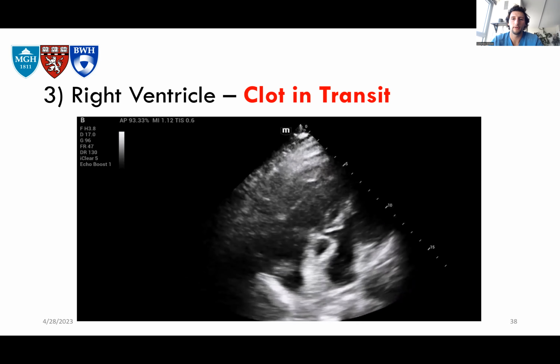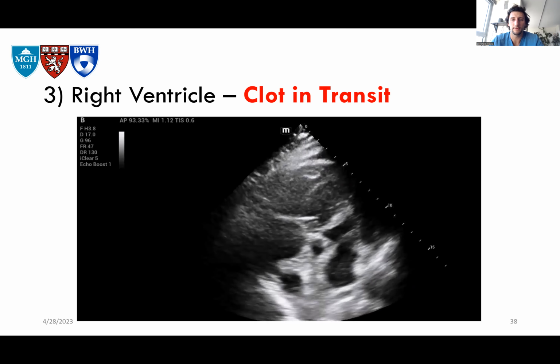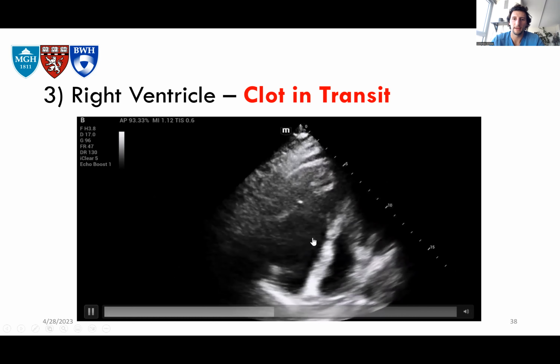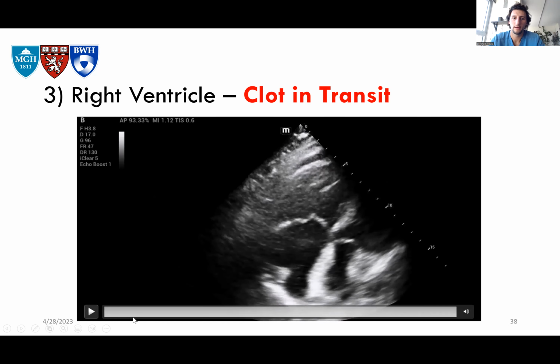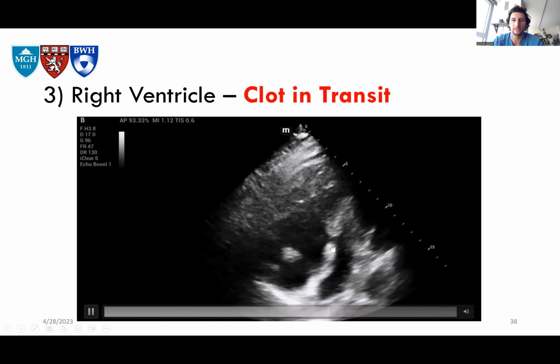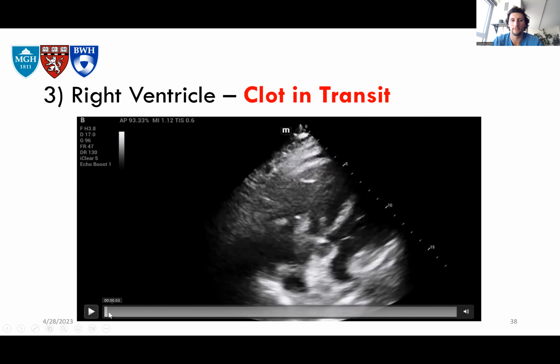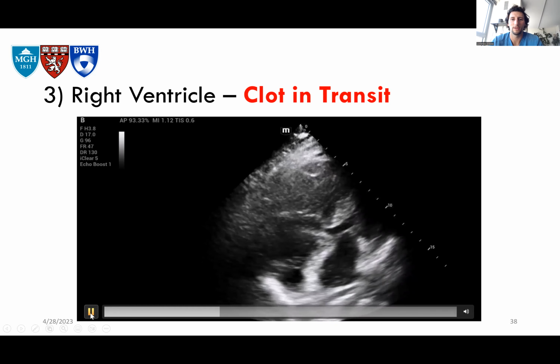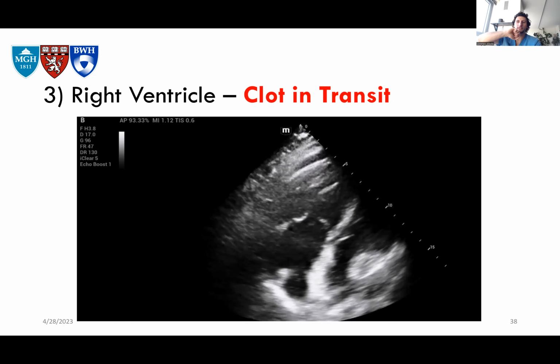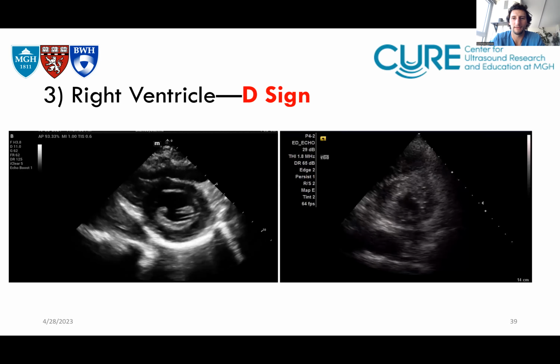This is an example, very rare. I've never seen this before, but it'd be kind of cool to see. Oh, let's see here again. See that little thing ping-ponging on the left side of the screen, that little white, looks like a ghost that's ping-ponging in and out of the valve? That's actually your clot. That's a piece of clot that's kind of bouncing back and forth. That's kind of cool to see.